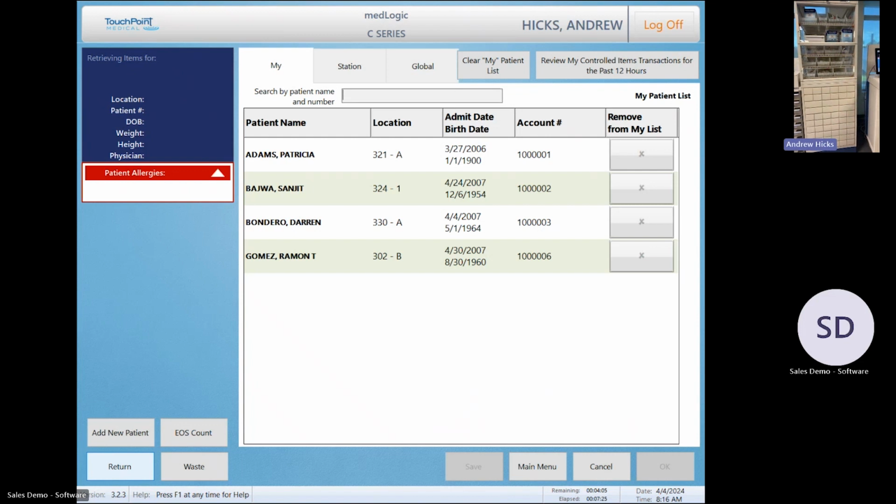So there's a lot of different options on the hardware. All that information is available on our website. You can download a brochure if you want from there as well.